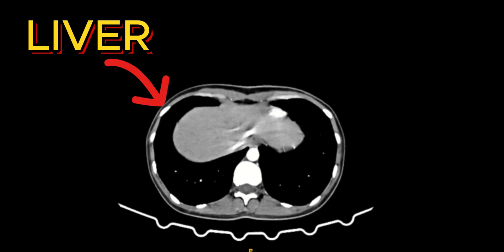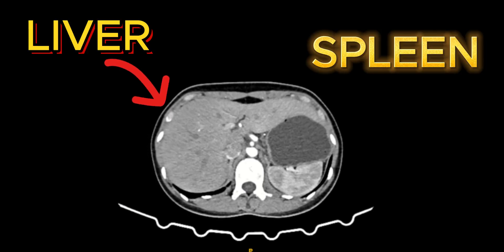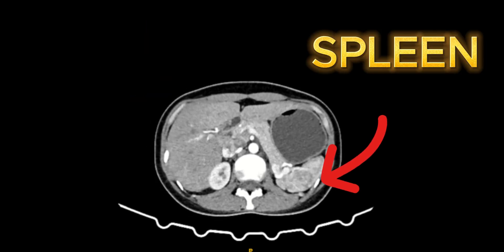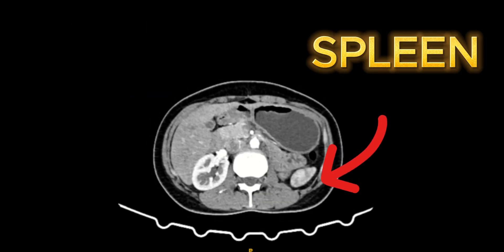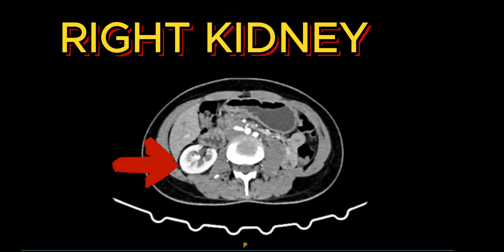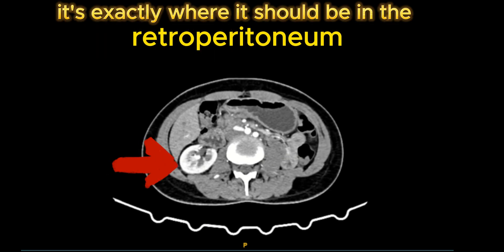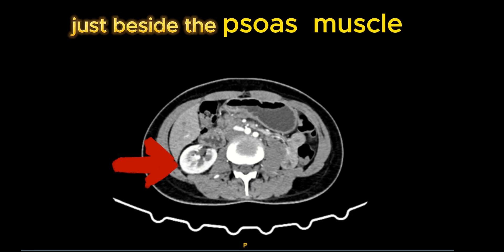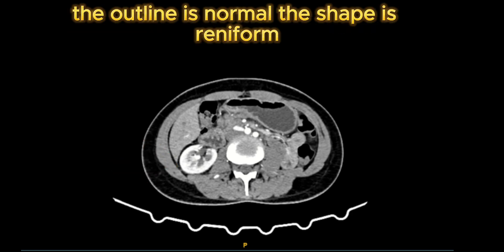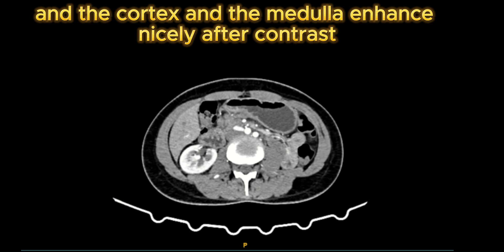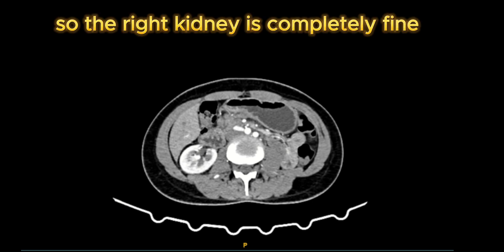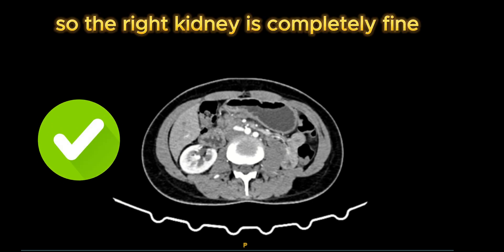Starting in the upper abdomen, here on the right side is the liver, and on the left side you can see the spleen. As we scroll further down, the right kidney comes into view. It's exactly where it should be, in the retroperitoneum, just beside the psoas muscle. The outline is normal, the shape is uniform, and the cortex and medulla enhance nicely after contrast. So the right kidney is completely fine.